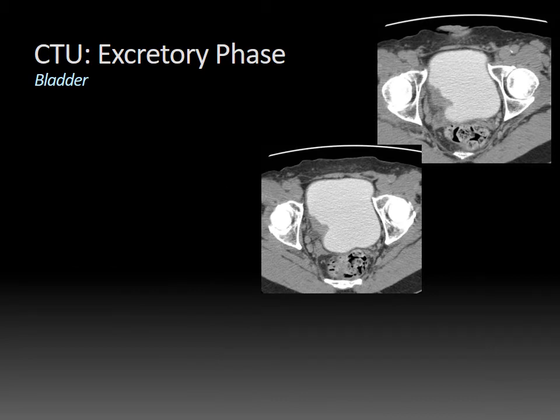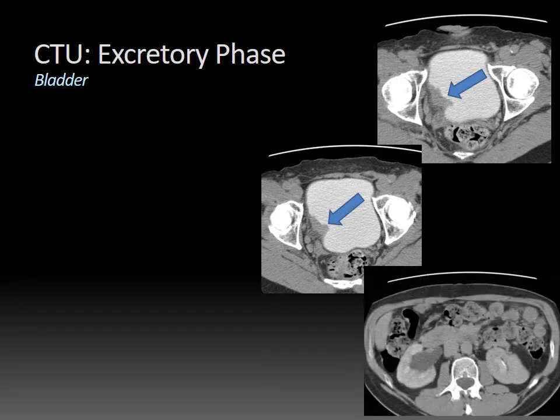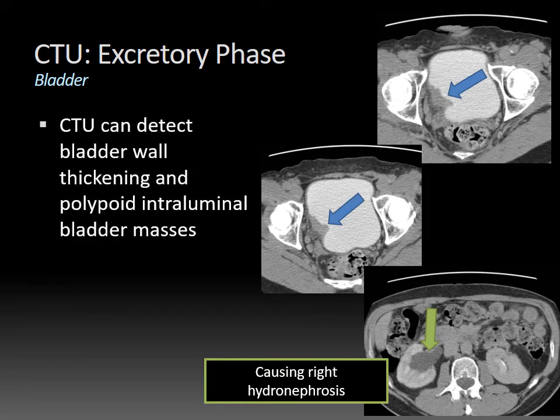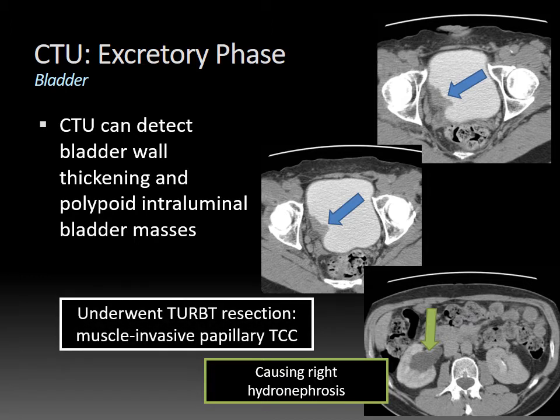Here is a different case showing excreted contrast within the urinary bladder. The contrast is homogeneous throughout the bladder because the patient either walked around or was rolled before the scan to mix excreted contrast with unopacified urine. The patient is in the prone position, and there's a polypoid intraluminal mass at the right ureteral vesicular junction. The right kidney shows associated hydronephrosis and dilatation of the proximal ureter. CT urography is excellent at detecting bladder wall thickening and polypoid intraluminal masses. This patient had a transurethral bladder tumor resection yielding muscle-invasive papillary transitional cell carcinoma.